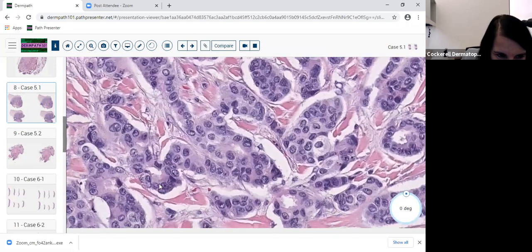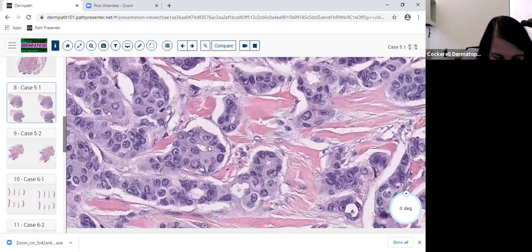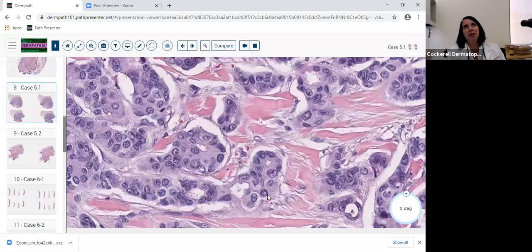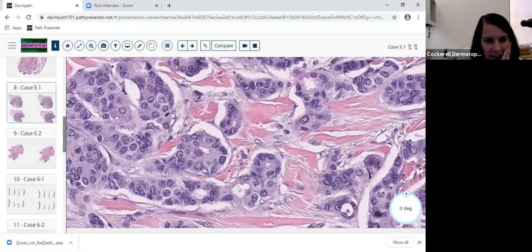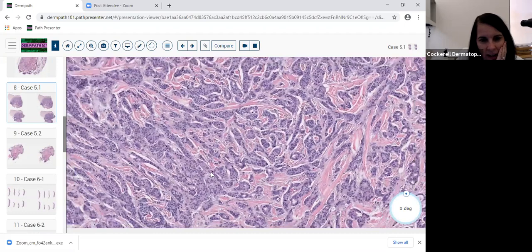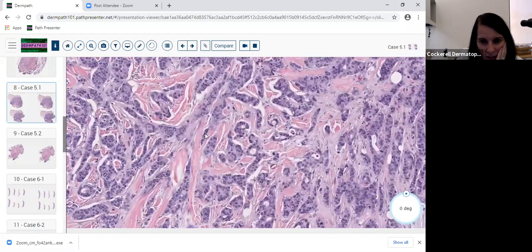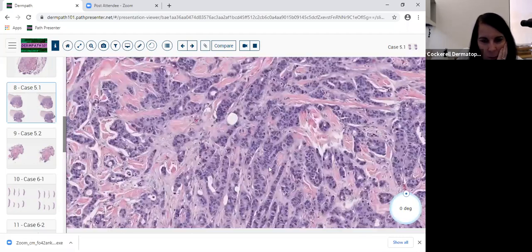These cells look epithelioid. And then I'm starting to see some glandular differentiation here. The minute you start to see glandular differentiation, you better be thinking about a MET right away. Think about a metastatic adenocarcinoma, and then start to think about where it's coming from. If you go off track and think, well, could this be a primary skin adnexal adenocarcinoma? You might want to do stains if you thought about that. But I think when you have this process going on with all of these glands, you really, really need to start to think about the possibility of a MET and where it's coming from.